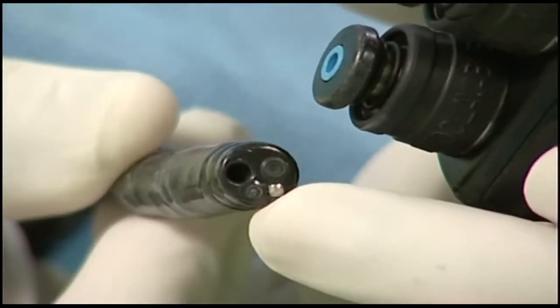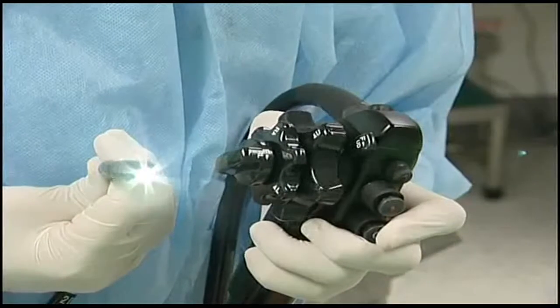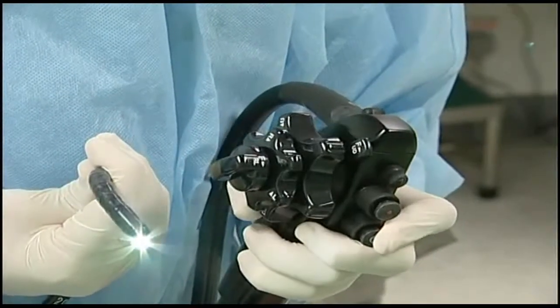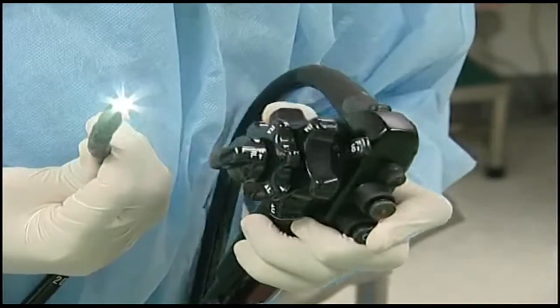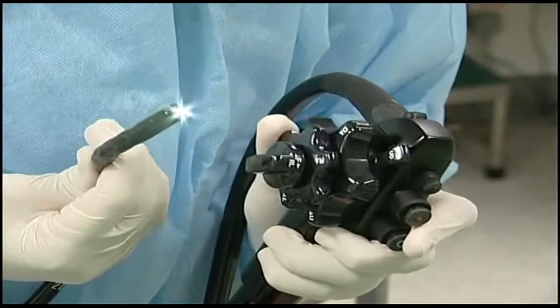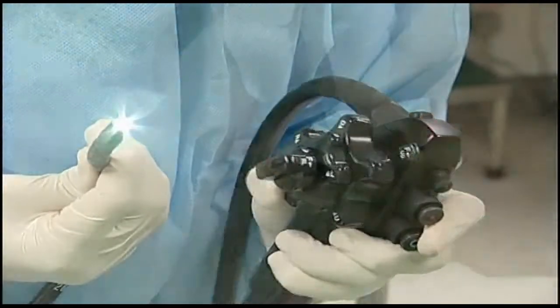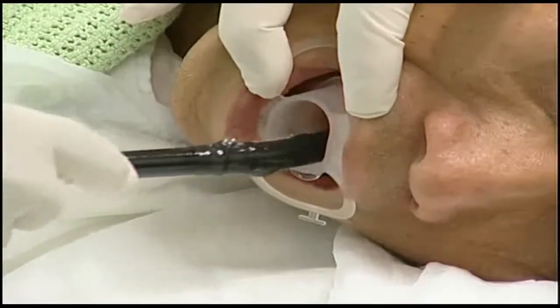An endoscope consists of an optical fiber cable with a small light source and a video camera at one end. The cable is flexible and can be inserted into the human body to enable the doctor to examine internal organs. The endoscope is inserted through the mouth into the patient's stomach.